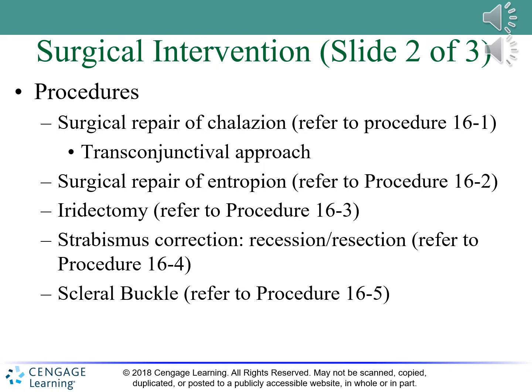Okay, so under the procedure, number 7, the procedural consideration, a caliper, and you can see that picture next to that figure 16-15, there's the Castro Viejo caliper. Make sure that you know that. A caliper may be used to measure the distance from the original point of insertion to the new one. The sterile marking pen may be used to mark the points of recession. So we're using a caliper, the Castro-Viejo caliper, on the strabismus correction. Make sure that you remember that.